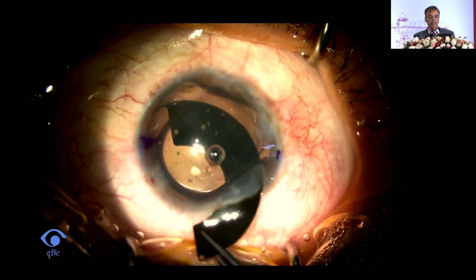Also, there are concerns about loss of pigment, but I've had a few of these patients over the last 10-15 years now, and most of them have done well. There have been improvements in these. Of course, Morcher makes these implants as well, but they are very, very expensive. So with no financial interest, the care group does do a good job of customizing these.